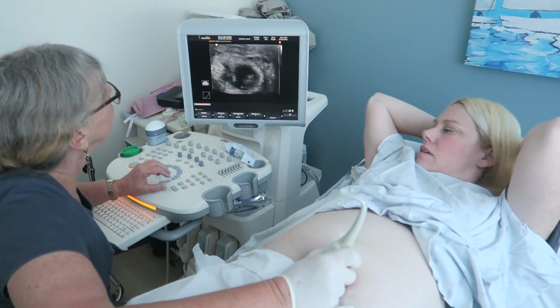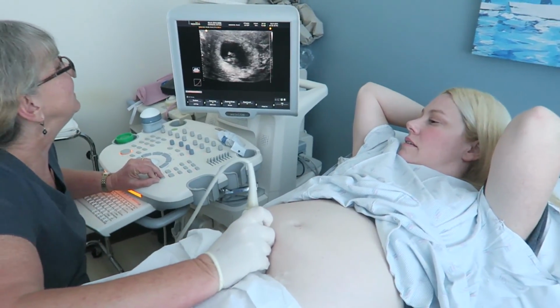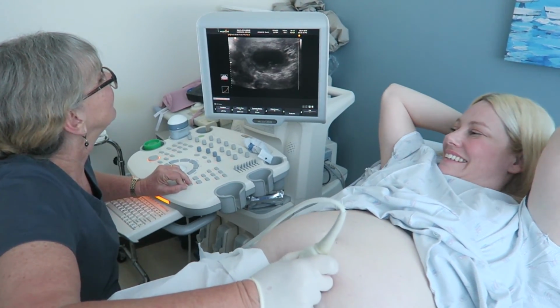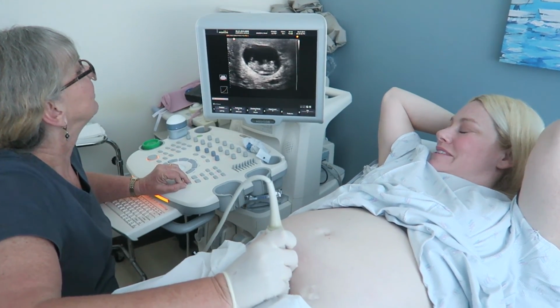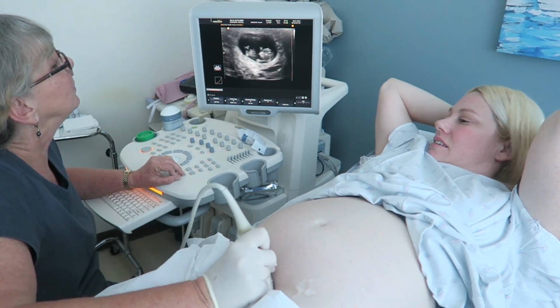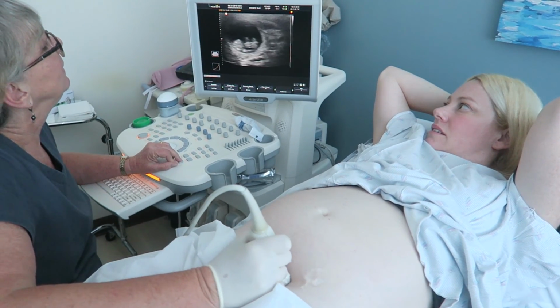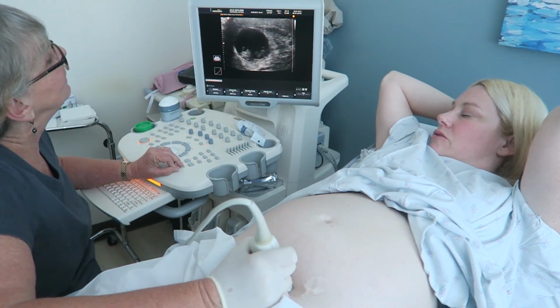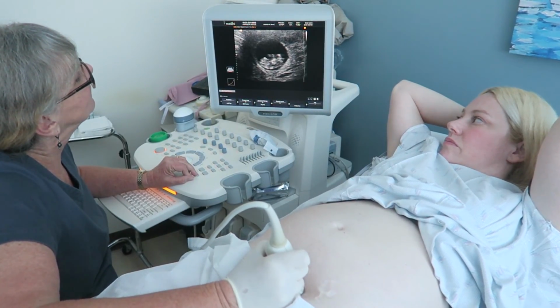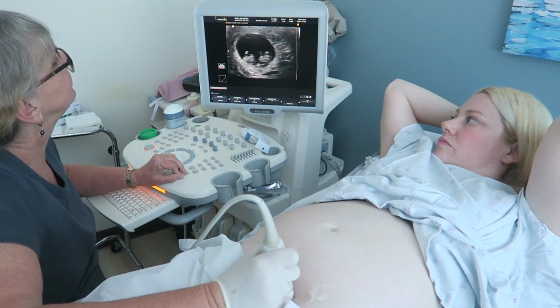So you think I had a period after May 28th? I don't know. Yeah, that I can't comment on. Oh, okay. I couldn't remember if I did. Just kidding. I couldn't remember. Sometimes menstrual cycles aren't real regular, so you can't use your menstrual date to date your pregnancy anyway. A little too little to get a little face. That's what I was trying to get. Almost. Just a little too deep, a little too small.